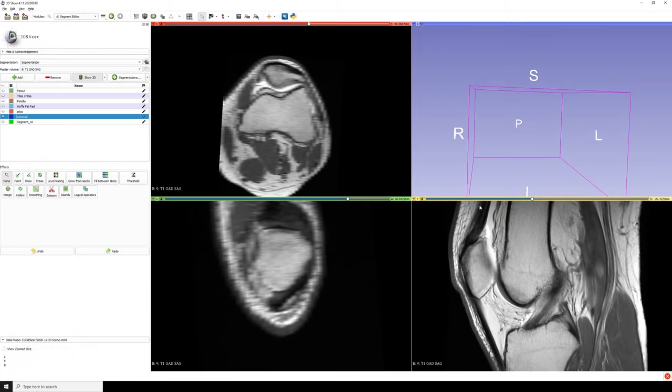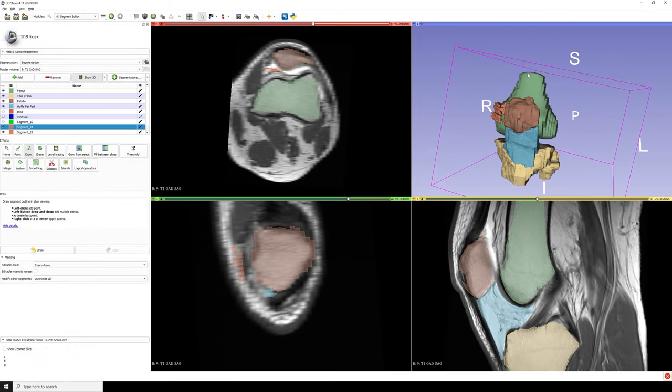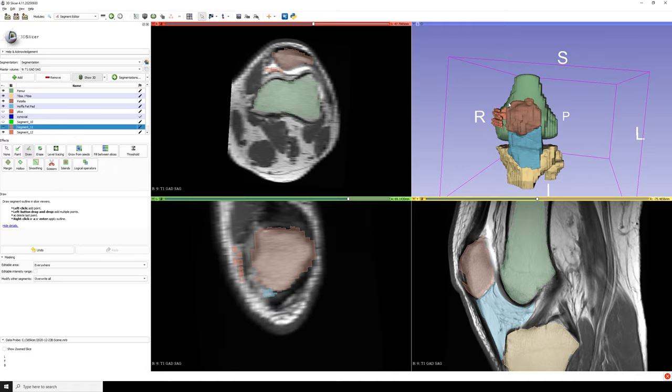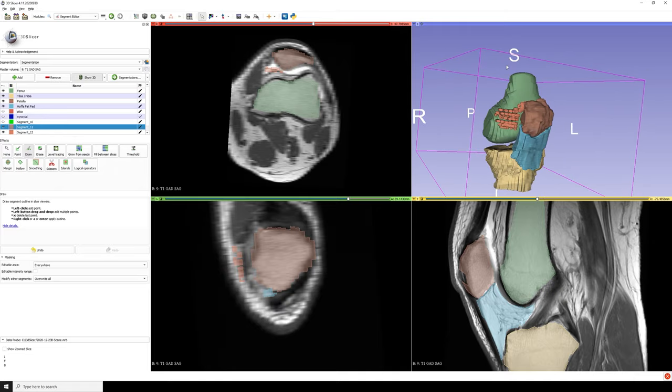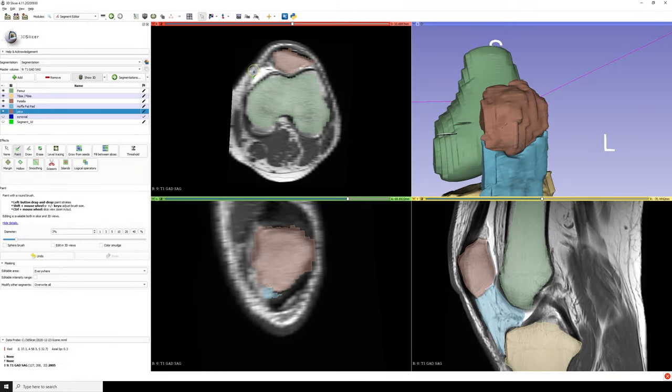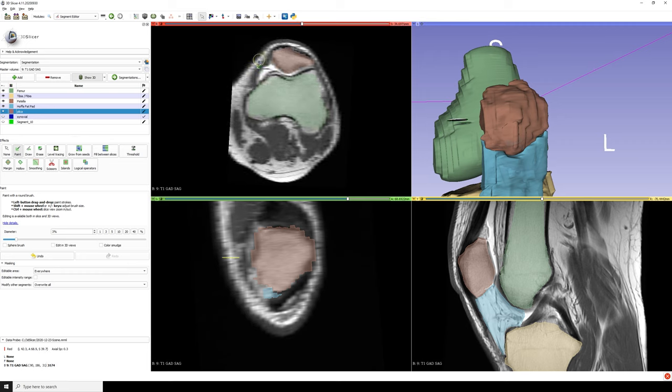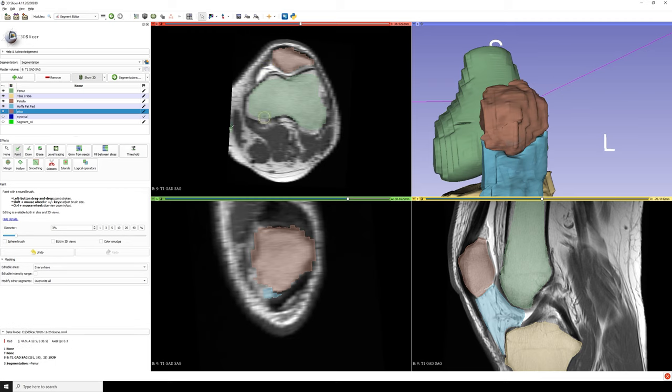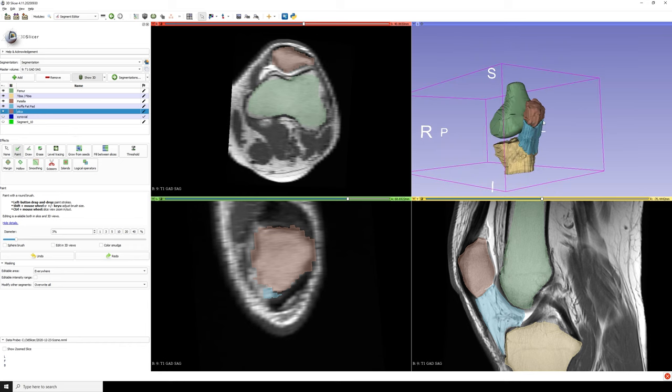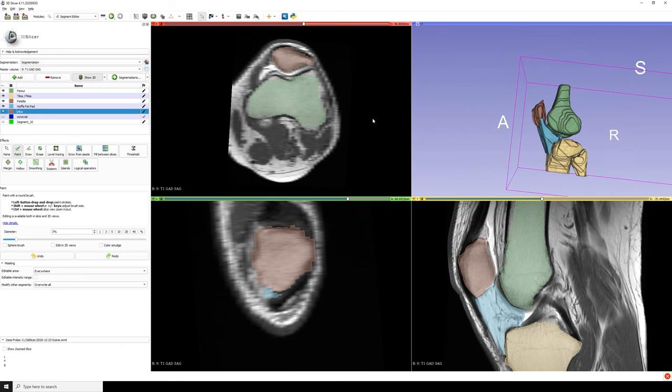So here we are in 3D Slicer. This is going to allow me to trace out each segment as I go through the images and it's going to build a 3D model off of this. You'll notice how blocky this is. That's because the amount of slices that the imaging takes is going to vary. If I wanted to spend more time on this to get a smoother model, I can actually have the software interpolate between the slices, adding more frames to trace. But I think for now, this should be enough to see the injury.